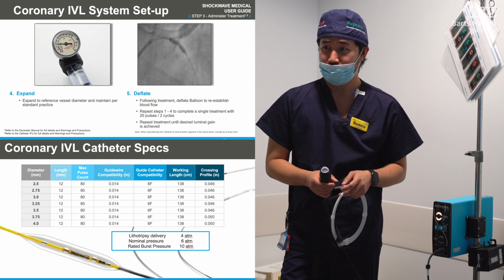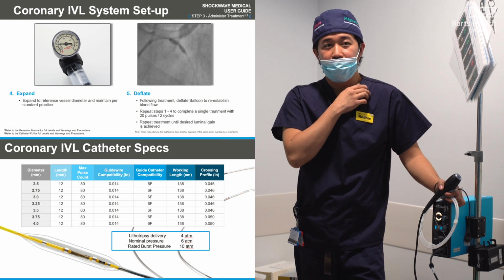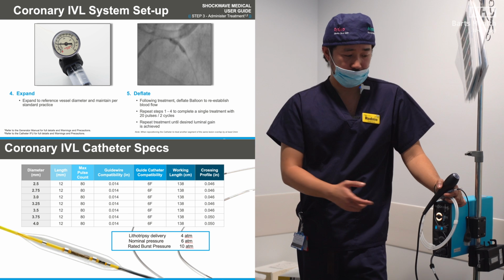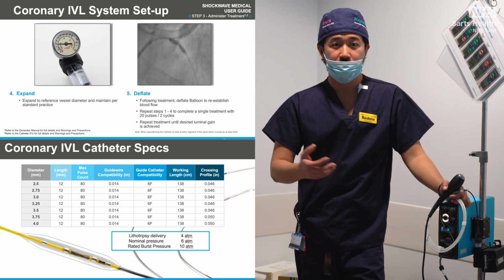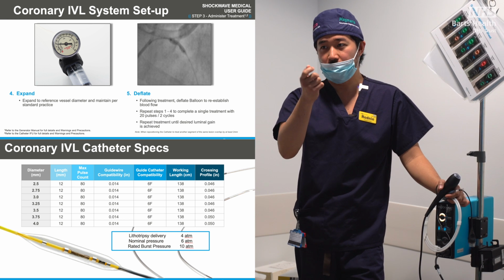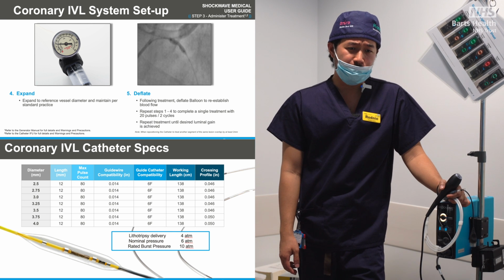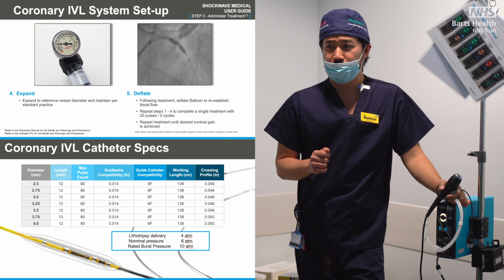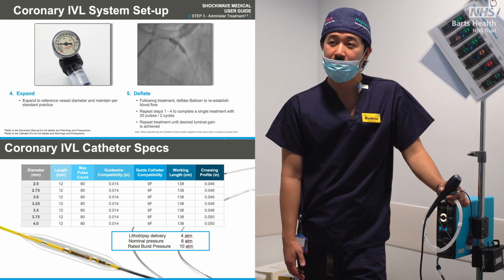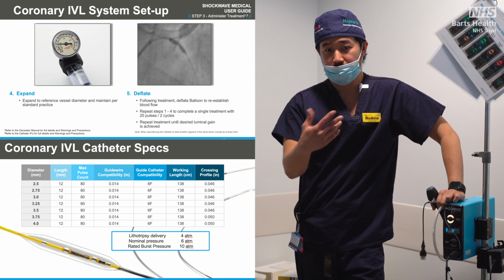So is it not going to replace rotablation? No. It will take a lot of the cases from rotablation because it's better. It's for the staff. It's easy to set up as well. No more IV fluids and less risky as well. Because with rotablation, there's a risk of the burr getting stuck, and you'll be in trouble once that happens. And also there's a high risk of perforation with rotablation. And also you need an operator that really knows how to use rotablation. Not everybody can use it from the get-go, unlike Shockwave, which is a normal balloon. So even though you haven't used this, you can use it from the get-go.